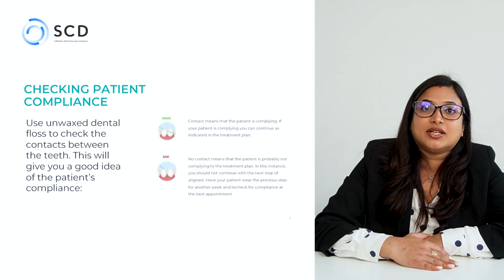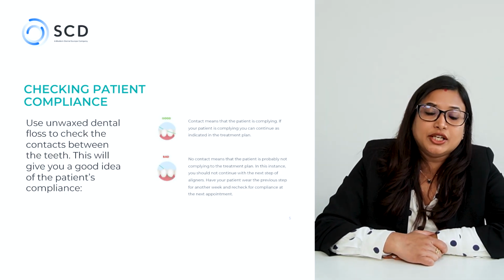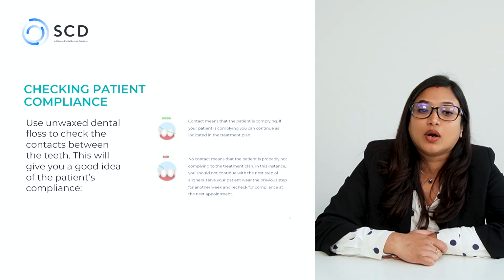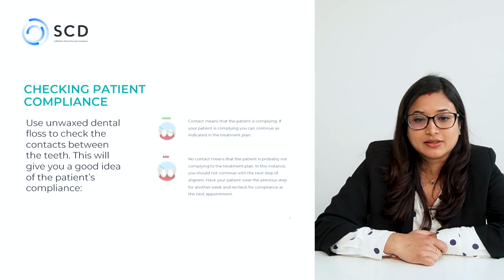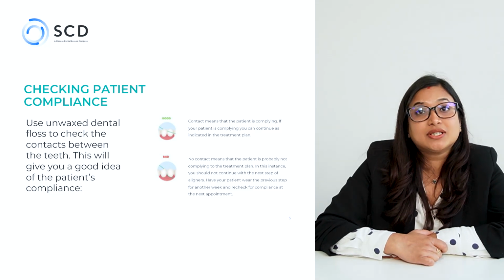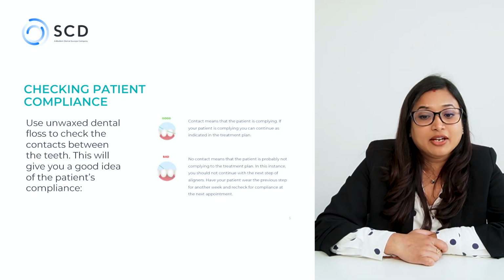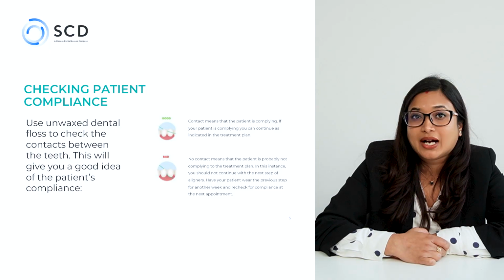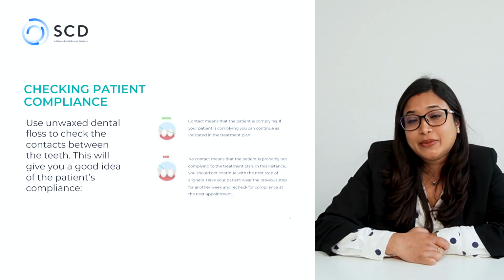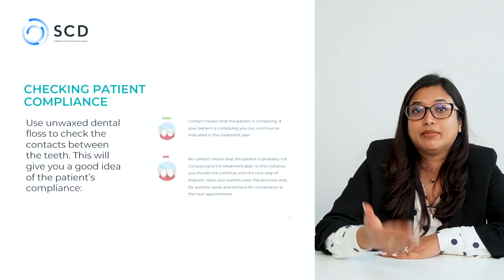Let's go with the patient compliance first. So how do we check for the patient's compliance? We usually use an unwaxed dental floss to check the contacts between the teeth. This will give us an idea of the patient's compliance. If the patient is compliant, then the contact will be tight and good. If there is no contact, then probably the patient is not complying very well, and we need to either enforce the compliance or probably backtrack to previous aligners and make sure that we restart or backtrack the treatment.